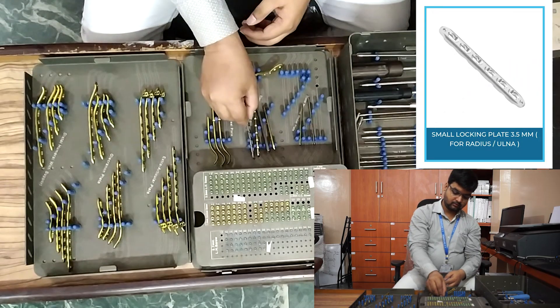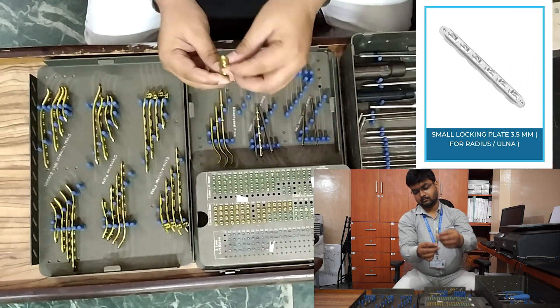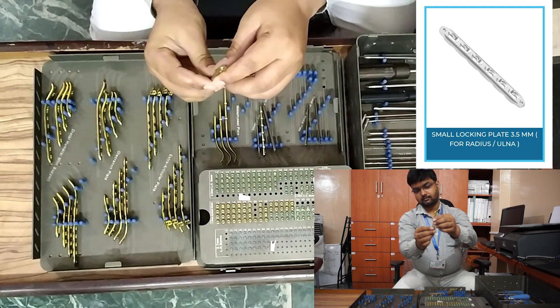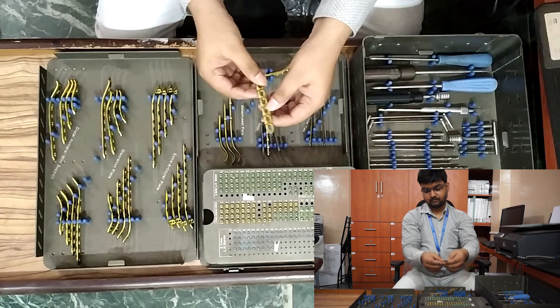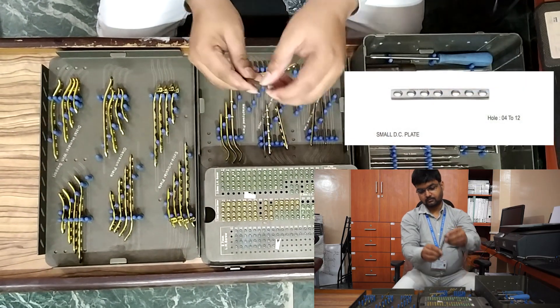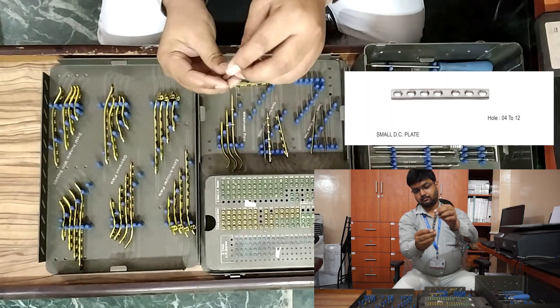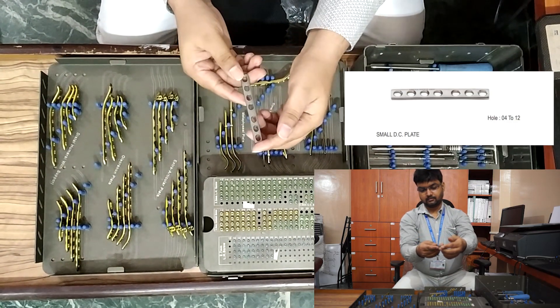Small locking plate: five-hole, six-hole, seven-hole, eight-hole, nine-hole, and ten-hole. Small dynamic compression plate, non-locking: five-hole, six-hole, seven-hole, eight-hole, nine-hole, and ten-hole.